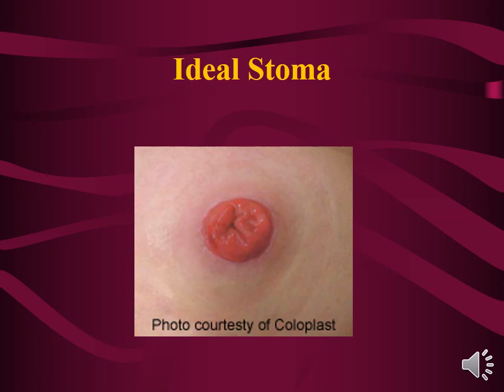pouch to stick, and so it was a two-piece pouch, but she was doing everything right, but she was only using the release paper, which doesn't really hold it on. That's just kind of a secondary measure. So I'm not really sure how she got a day and a half out of it. So anyway, we should all be familiar with how to change a pouch and how to empty a pouch and how to assess skin and stomas. And I think that all of us can do that.